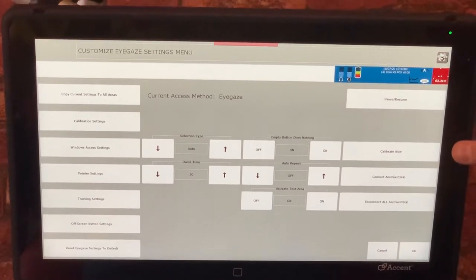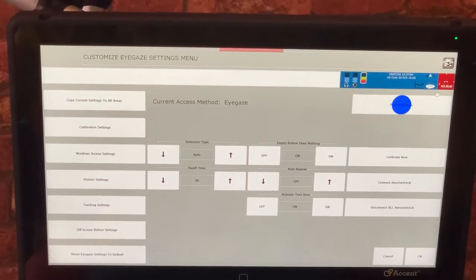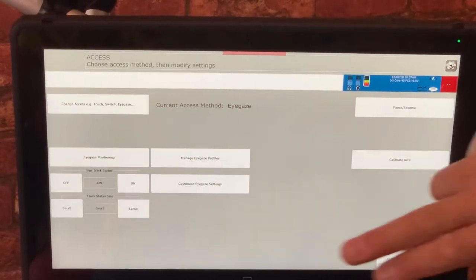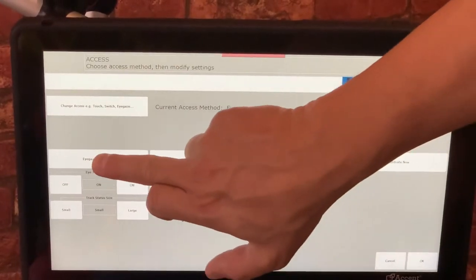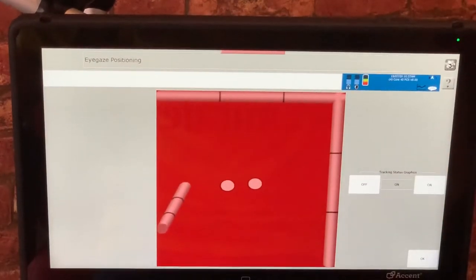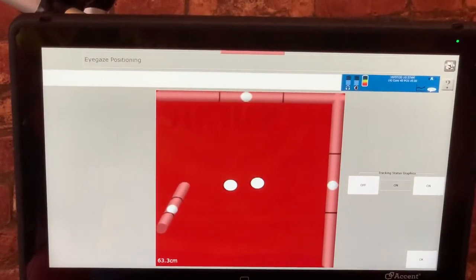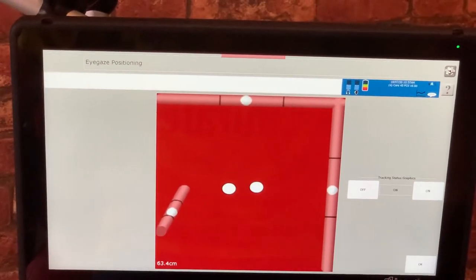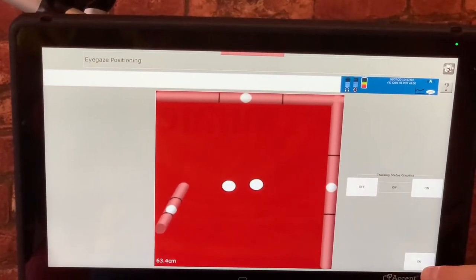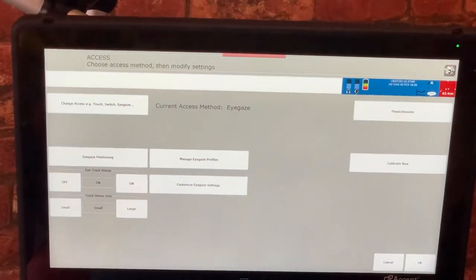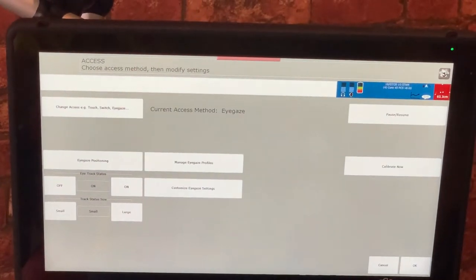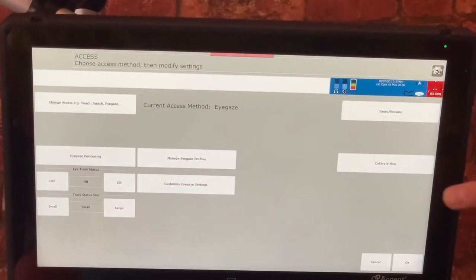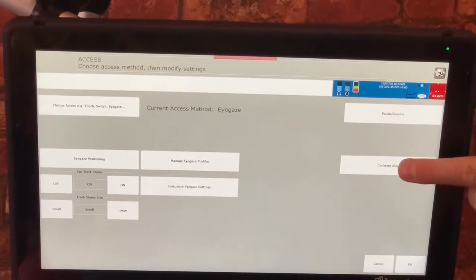Before I go ahead and calibrate now though I'm just going to press OK once more because it's important that I check that the client is still in the right position. I'm happy with that and so now we're going to do a calibration and I'm going to stand away from the device so it doesn't catch my eyes.